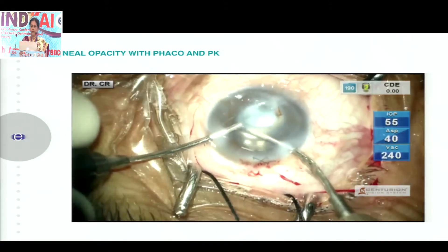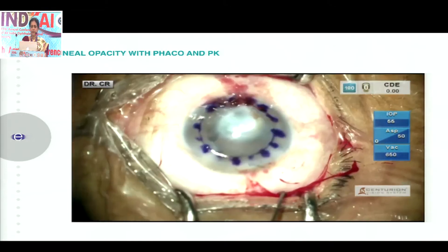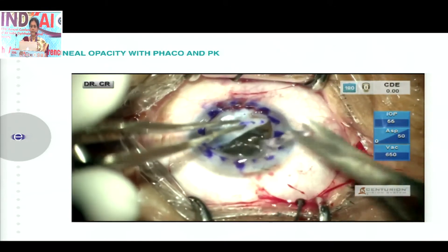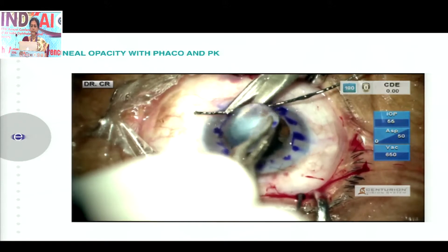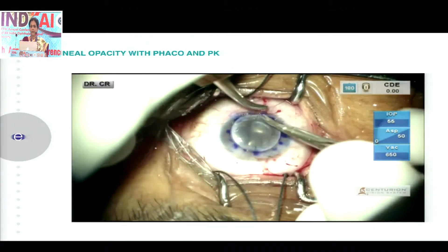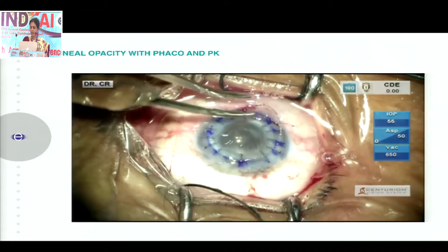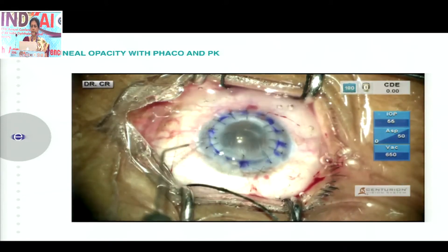Once the IOL is placed, you use a trephine and remove the diseased corneal tissue. Then all that is left is to do a PK or anchoring sutures and complete the case.